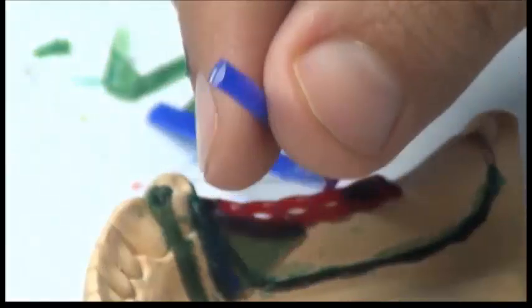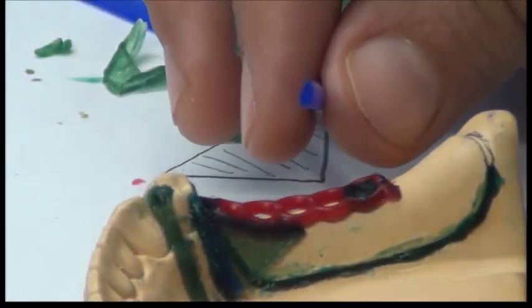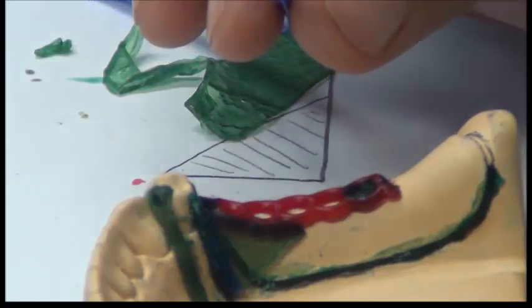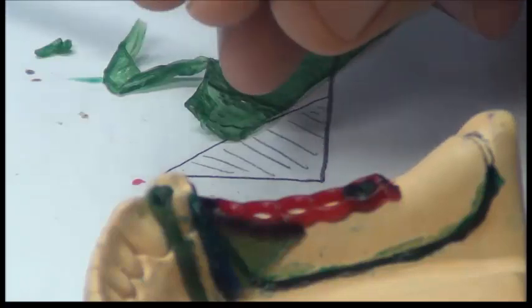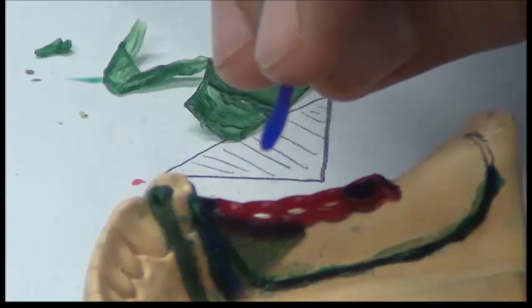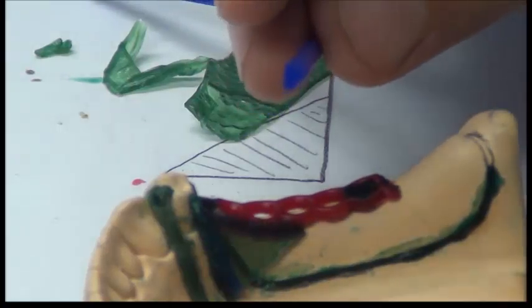And this is one good thing about metal. You don't need in the metal the full thickness of a plate, as in acrylic. Remember, with temporary acrylic, the only major connector in the lower should be a plate. In the metal, I could place smaller components such as a lingual bar. Now, look at the cross-section of the lingual bar.